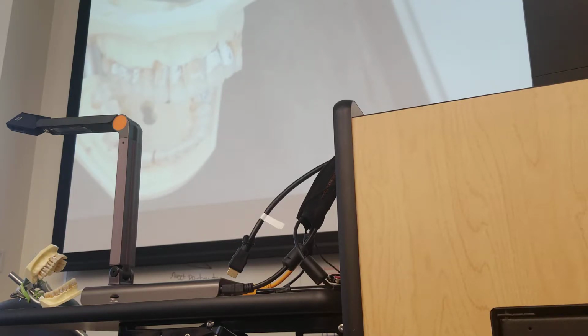Well, I don't understand why we can't put it right there, because we're looking at it like, oh, but this is the same thing. Okay, how are we doing? So does it point the toe at you? Make sure the lower shank crosses, and this would be the outer edge.